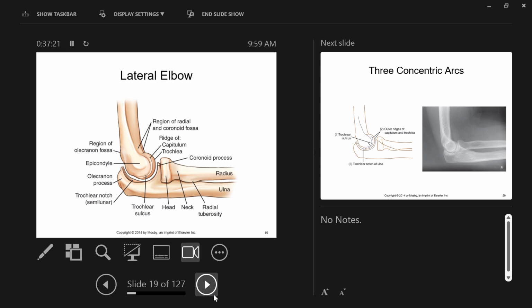But even easier than all of those things, just have the patient hunch down, right? Any of those things that you said are useful and they will work, but you can also have the patient just hunch down a little bit, a tiny bit of an awkward position for a moment. As long as they're stable enough to stay in that position, you're going to be just fine. Okay.